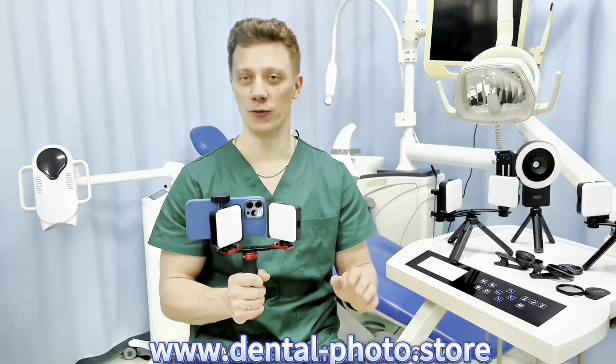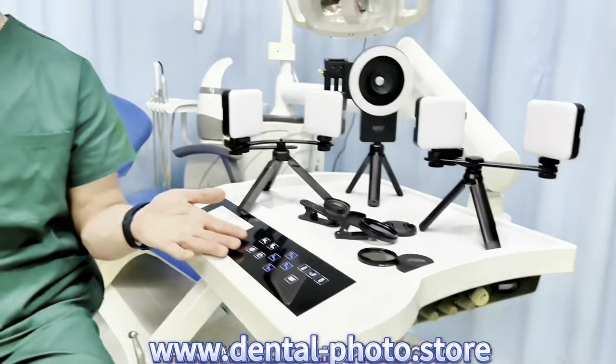Welcome to my store! Our company produces products for dental photography. We've already got quite a few models for you to choose from. They are all patented and we are the manufacturer.